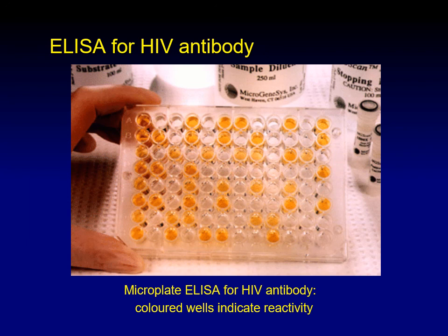You can see here this plate is used for the detection of HIV antibody, meaning that we have a specimen or a sample of serum taken from a person who is infected with HIV and is treated through the method which we just mentioned earlier. Once we see the color changes, this will clearly indicate whether the person has HIV or not. Of course, we tend to use controls. We have negative controls and positive controls, really to help in identifying the appropriate reaction.